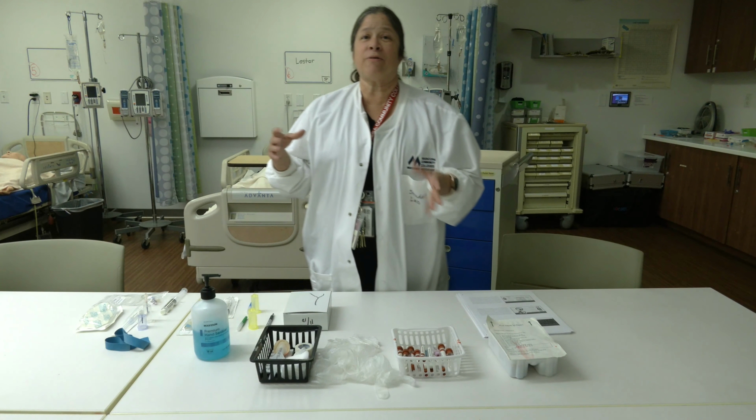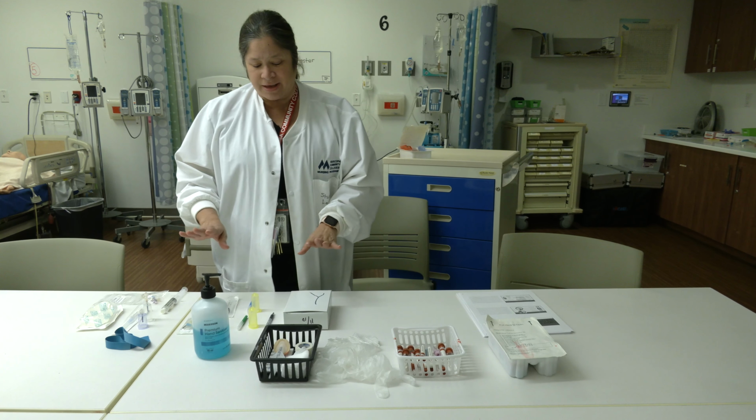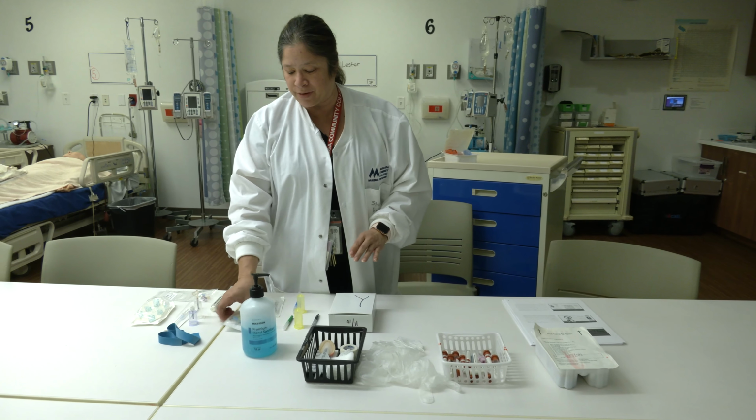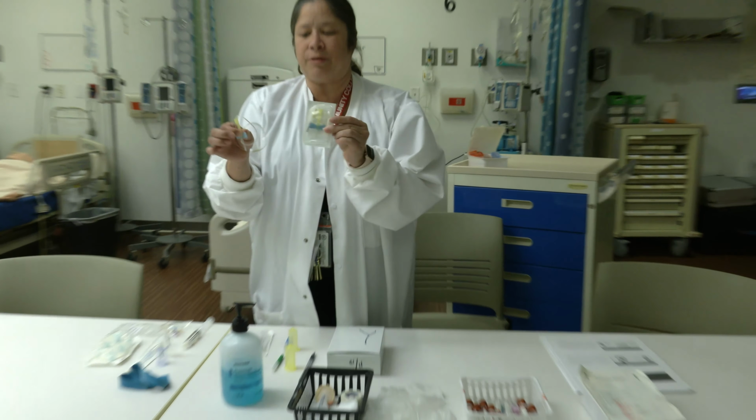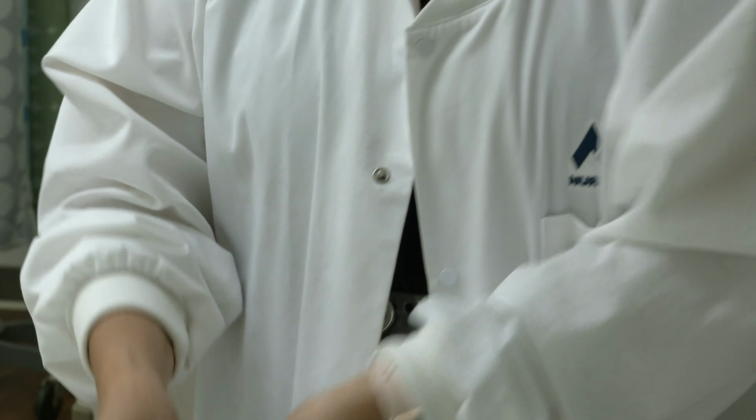Okay, so I'm gonna go over all the equipment that you picked up so that you can work with that. So we have things that I want you to work with. One is a butterfly. You either got one in a baggie or you got one already packaged. These are what we're gonna use to draw some blood.